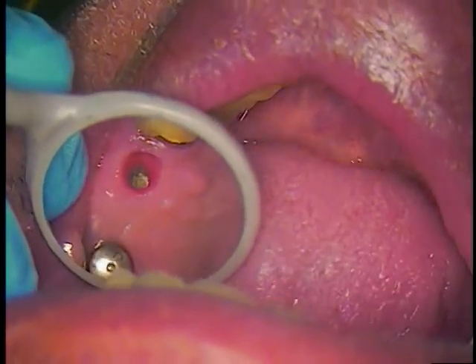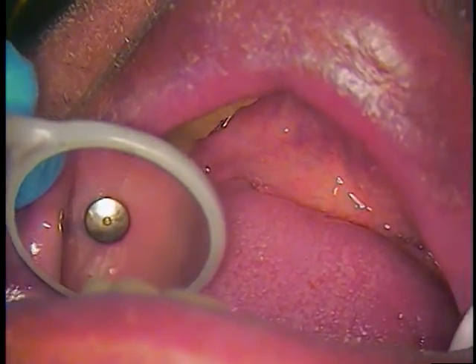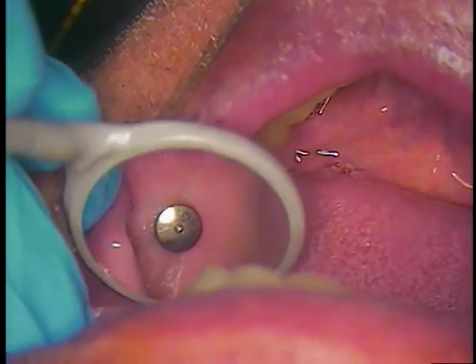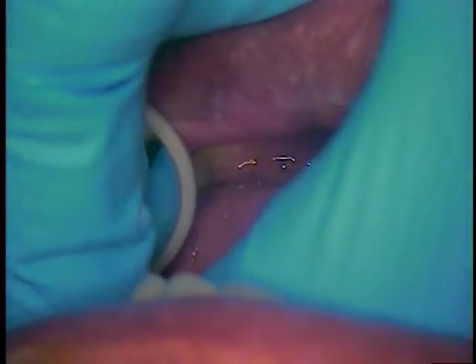I'm going to be showing also the lab portion — very interesting. We're going to film that so those who are interested can copy that idea. I don't like to have everything assembled from the lab. I'd rather do the assembly work myself — that gives me total control. If the lab does it and then you've got to add a contact, they have to try to get that cement out of the abutment and the crown portion of the retainer. You end up oxidizing the metal, with problems including surface oxidation on the screw. Plus, the screws are laser welded, so you don't want to reheat things. That's why we do them in segments — takes a little longer, but you get a much better result.